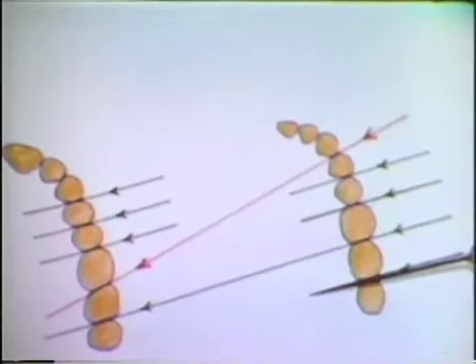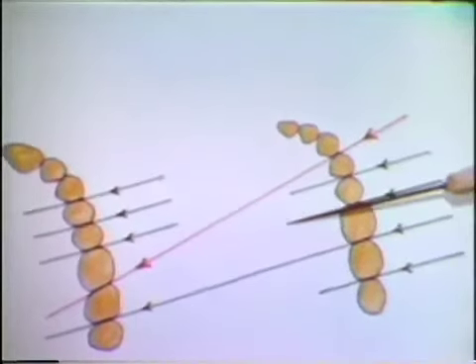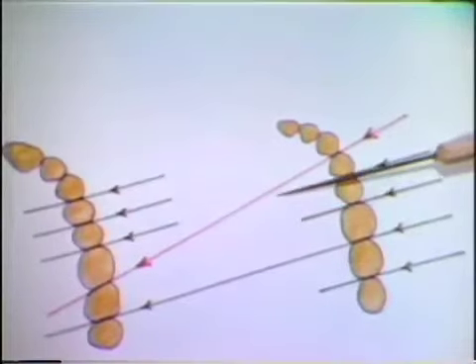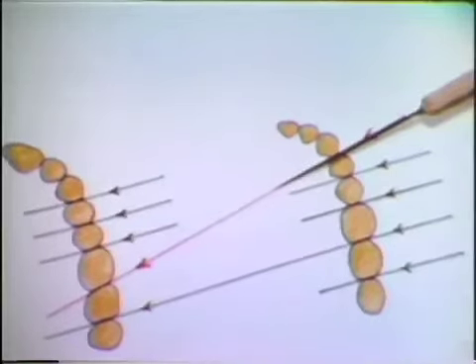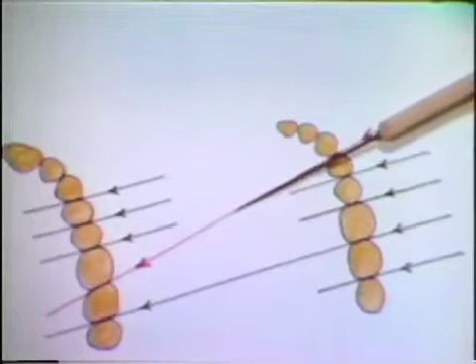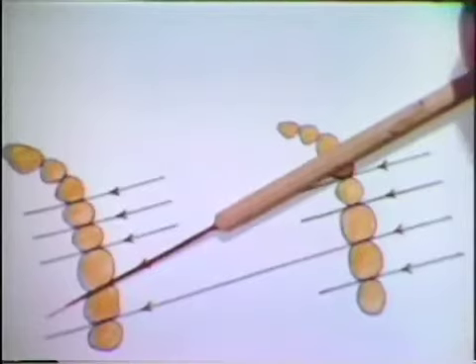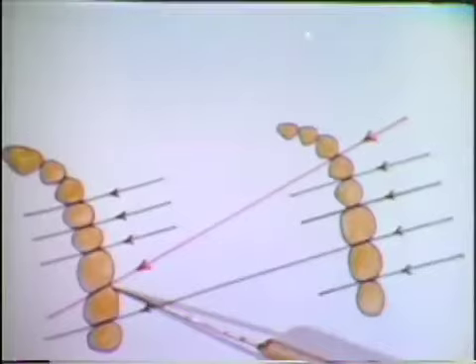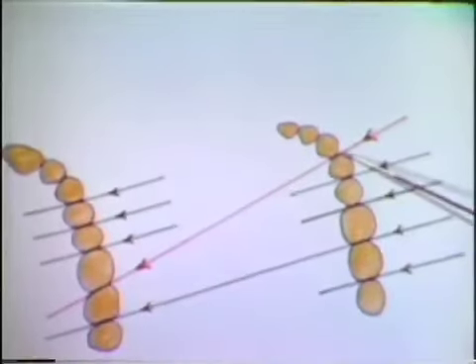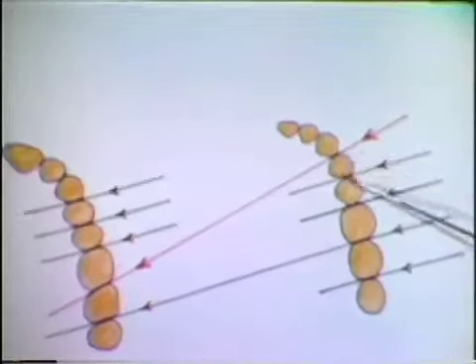In the mandibular segment, the initially established direction is also suitable for the lower interproximal areas, with the exception of the cuspid first bicuspid contact. A supplementary film with an altered beam direction would also be necessary here. Note that the altered beam direction coincides with that used to open the contact between the upper molars. In some cases, then, only one supplementary film may be necessary to remedy both discrepancies. Others may require an extra film for each discrepancy noted, however.